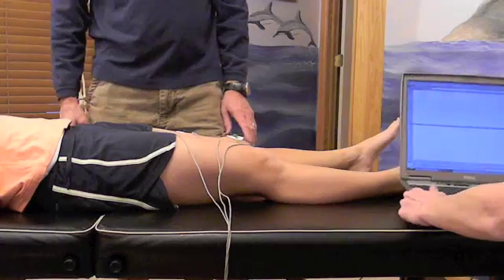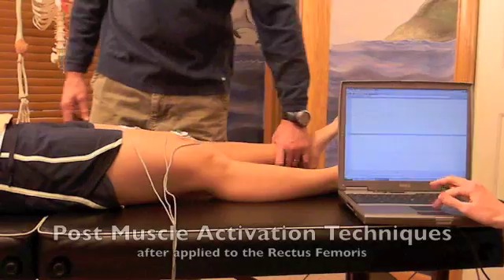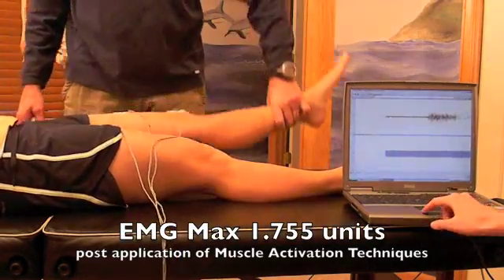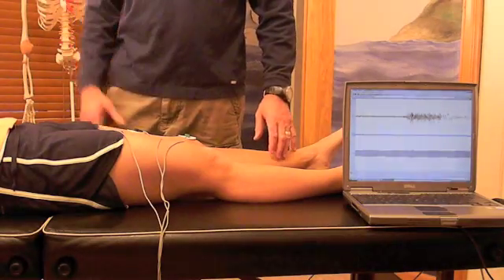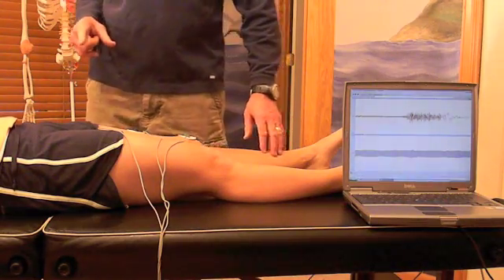Now we're going to repeat the same test. Dana's going to lift her leg. Hold, Dana — ready, resist. Good. You can definitely see a different amount of force she's able to use, and she's able to sustain it for a whole lot longer time period. Now we're going to try something.